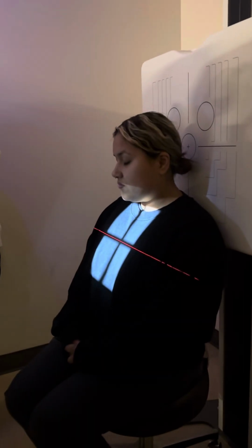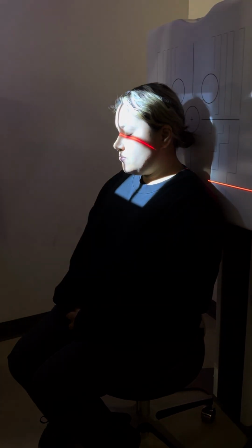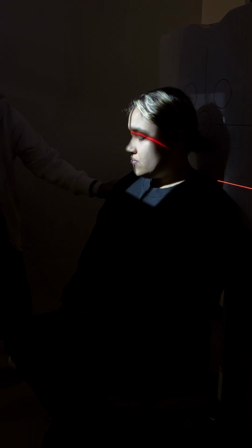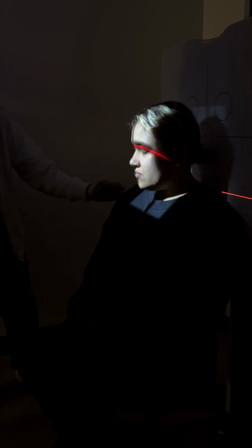Okay? So we do this Towns view, but we actually set it up at the glabella instead of above the glabella for this. When you look at the image in your textbook, you're going to notice it looks kind of like an alien. It shows a really elongated face, and now we're seeing these zygomatic arches projected down the face to see whether or not they are communicating with each other or they're fractured laterally.